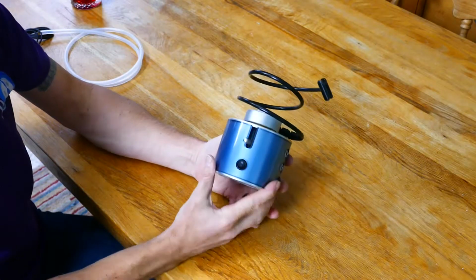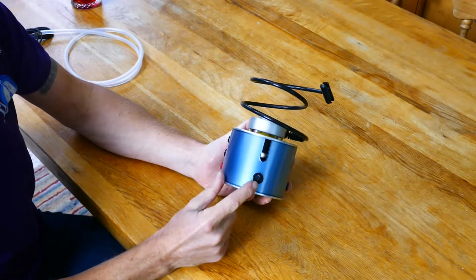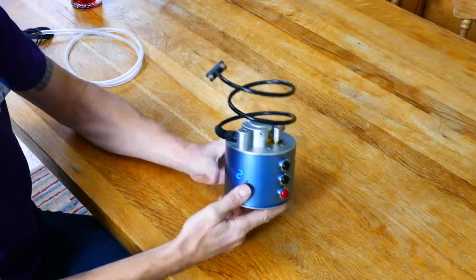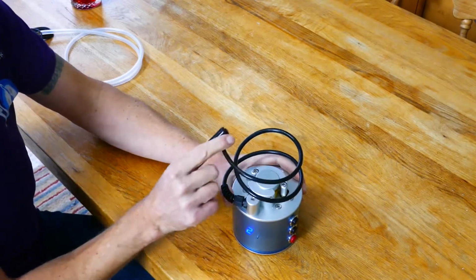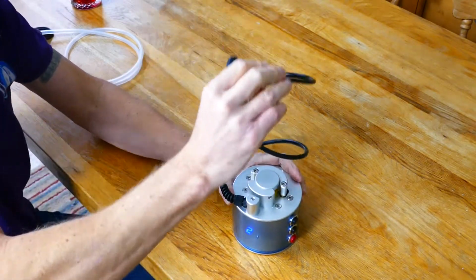To use your powered drinker, the first thing we need to do is to switch it on. With the number at the front, I'm going to then get hold of the straw holder and lift it up out of the way.